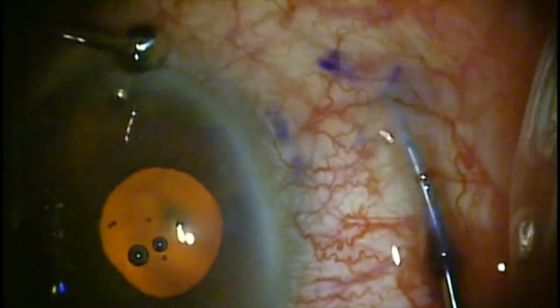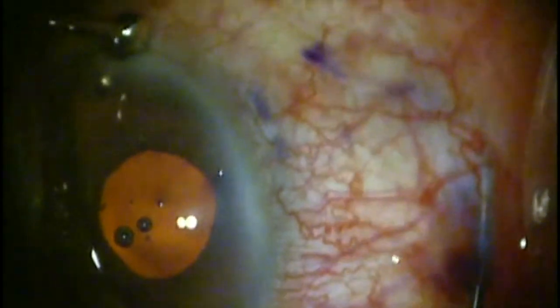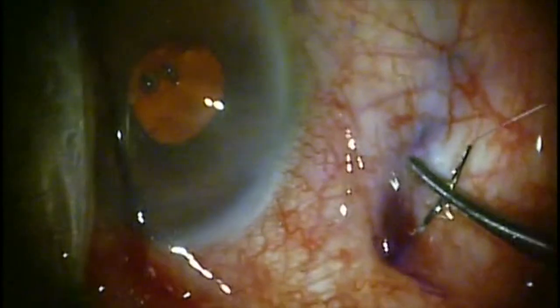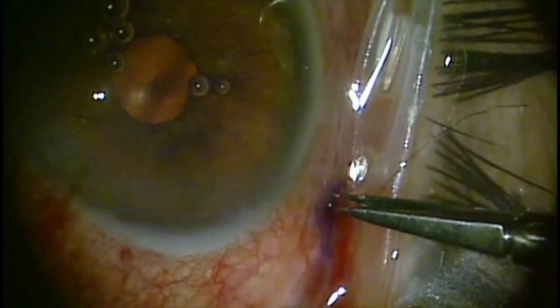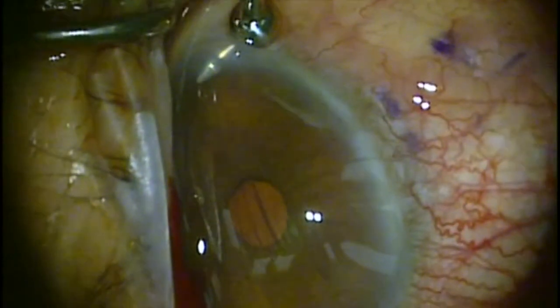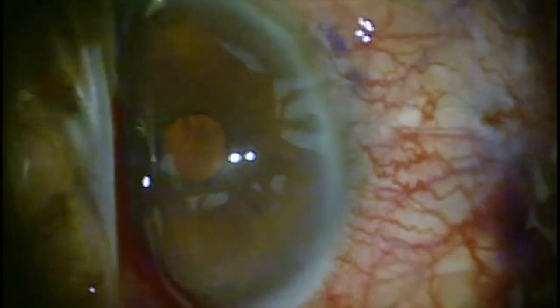At the conclusion of the needling, I prefer to close that track with a 10-0 nylon or 10-0 vicryl suture so that there's no possibility of leaking through that. Then we inject 0.1 milliliters of 0.2 milligrams per milliliter mitomycin C approximately 8 millimeters posterior to the limbus, and hold compression down so that it does not flow anteriorly.